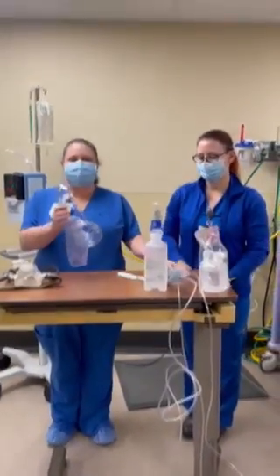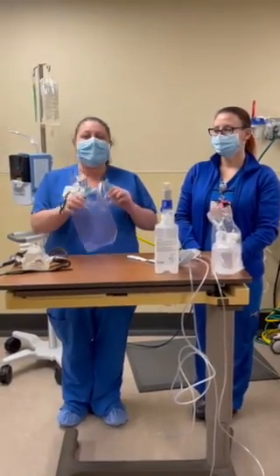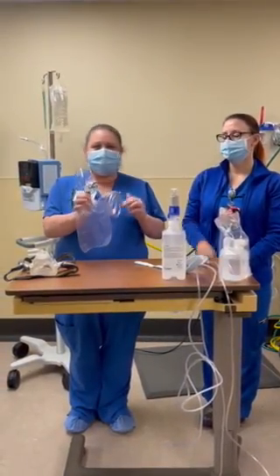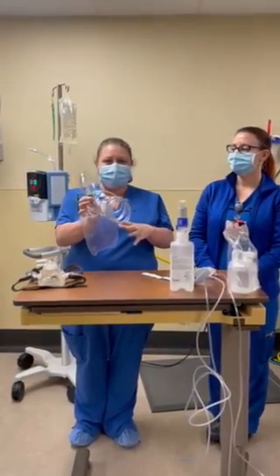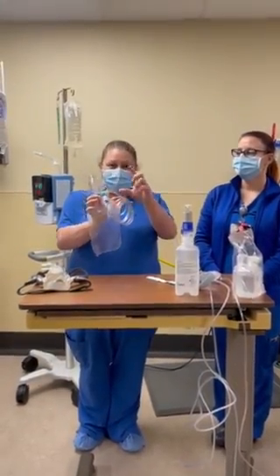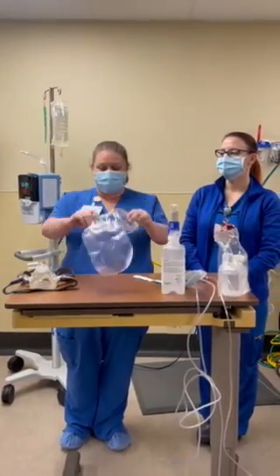If you find that these devices aren't working, you need to call us. They are located in our department. 15 liters. You do not wean the flow on these. You want the bag to be expanded. When the patient takes a breath, you need the bag to be at least half full. Okay? This is only in our department.